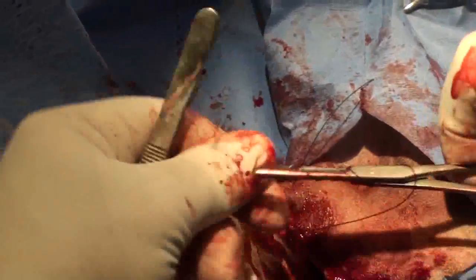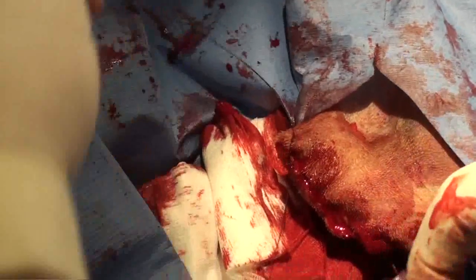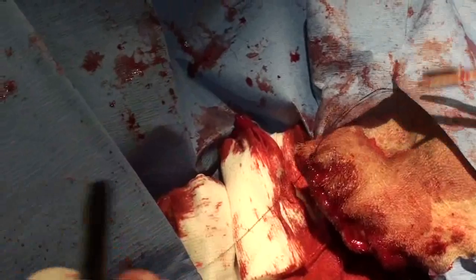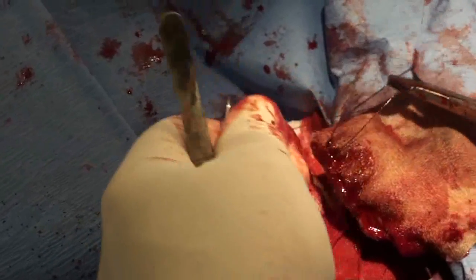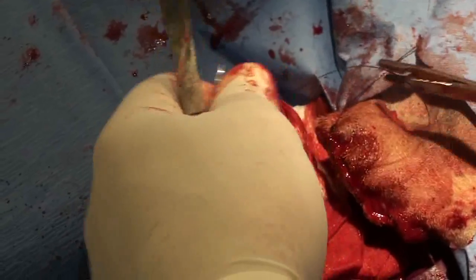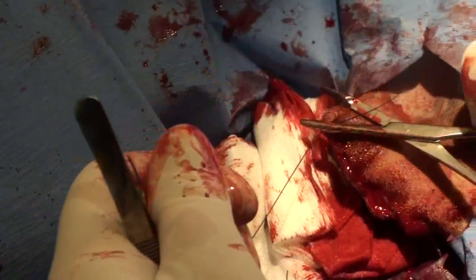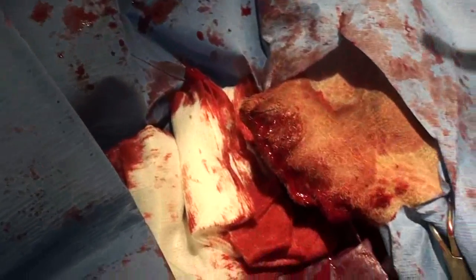We wrap it three times and bring the skin edges together. You don't want to tighten it too much, because if you tighten it too much it cuts off the blood supply, and if you cut off the blood supply it can't heal. Remember, we're not sewing together furniture — we're sewing together skin. It's really important to allow the blood vessels to get in there.